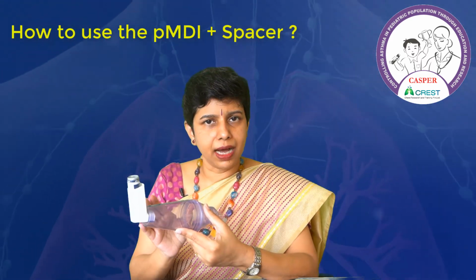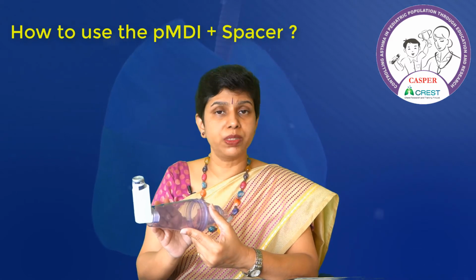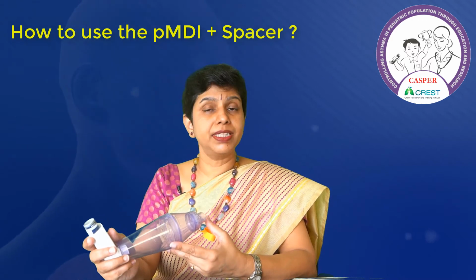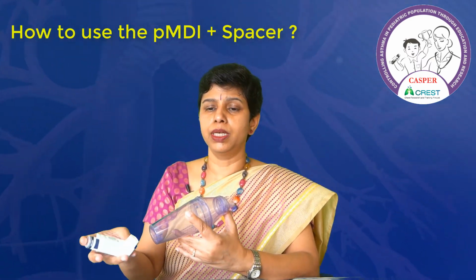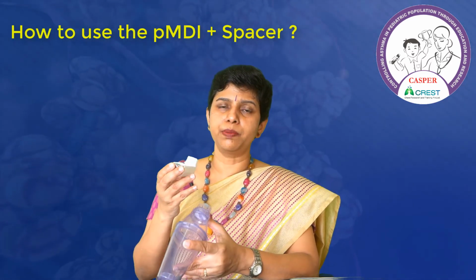So again, ask the child to take a slow and deep breath through the spacer and hold the breath for 10 seconds. If it's a younger child who cannot perform this kind of controlled breathing maneuver, then what we can ask the child to do is to breathe in and out of the spacer, where the first breath is out and then we actuate. Please note.